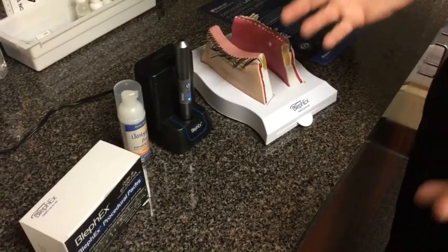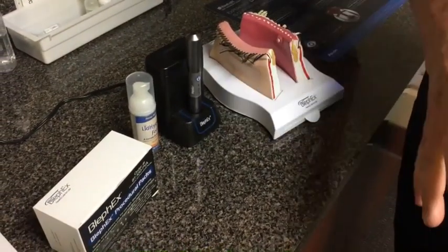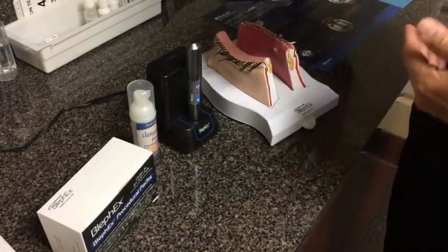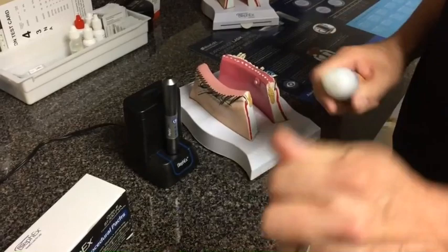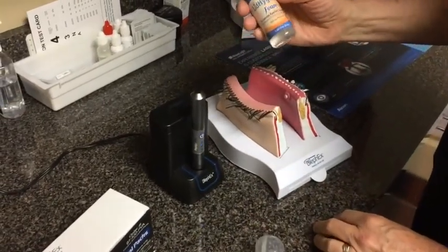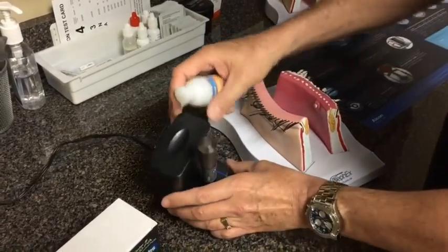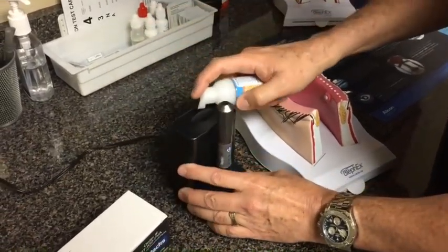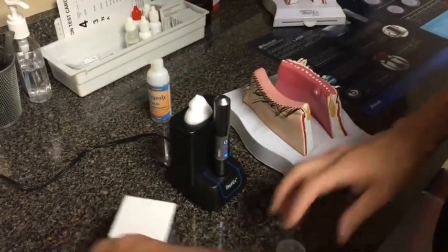Now, the very first step in doing a BlephEx procedure is very important. We're not putting numbing drops in right away. Our first step is to turn to the handpiece and the tips. And this is step number one. We want to put the foam, the lid hygienic scrubbing foam, or the BlephEx scrubbing foam into the back of the reservoir. You can see a little depression back here, and we're just going to pump that right in. 3 or 4 pumps of foam, and let that sit.